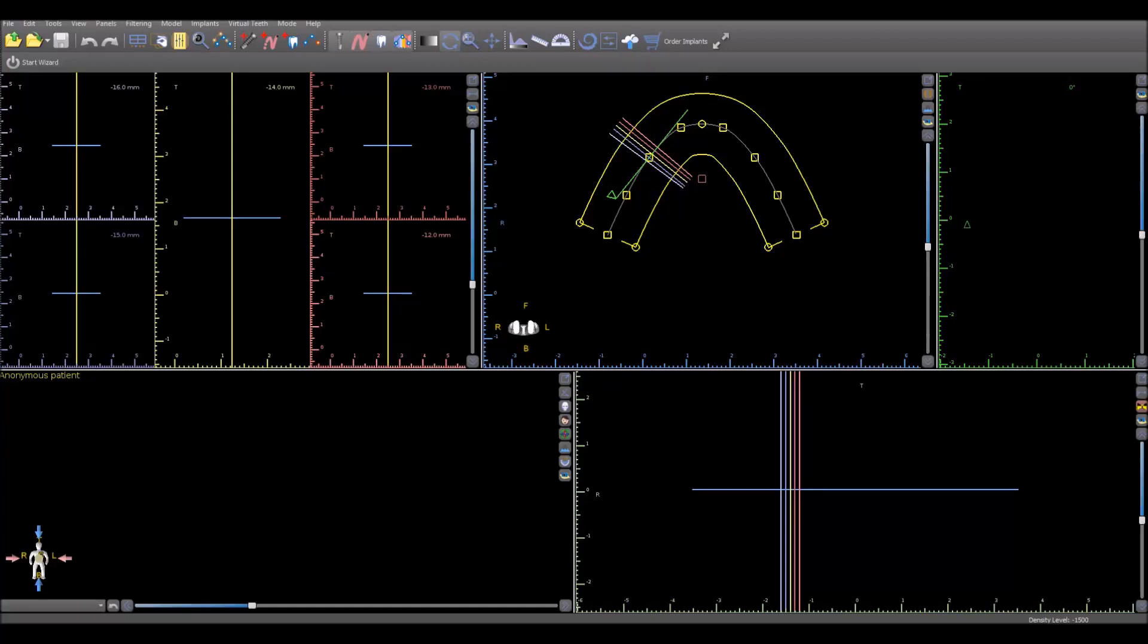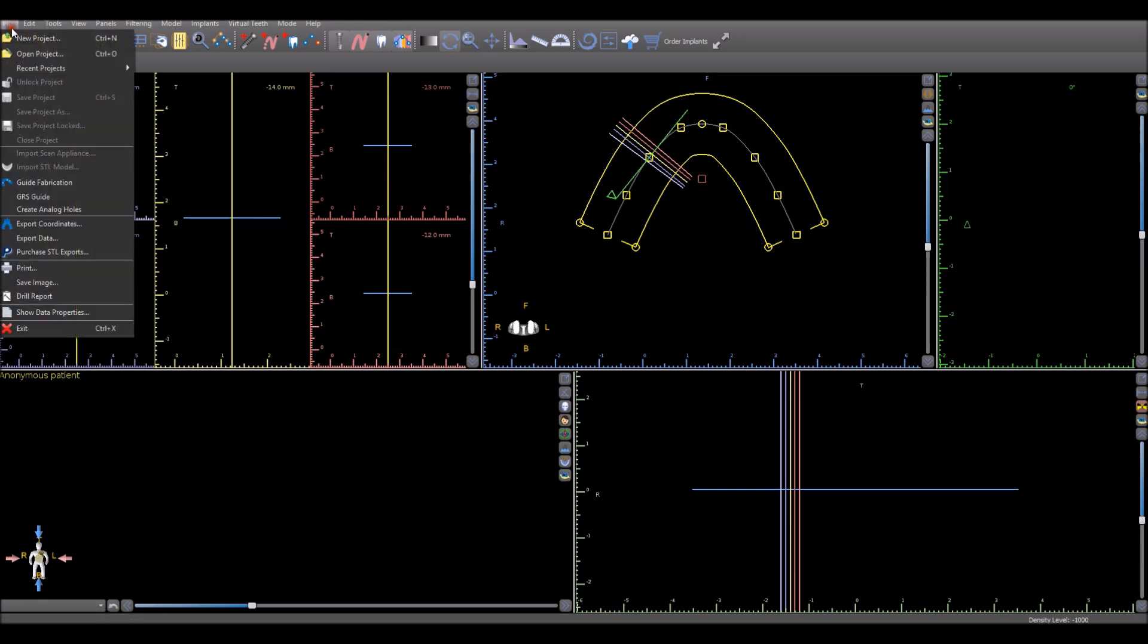This is Michael from Blue Sky Bio. I wanted to take a few minutes to run through the process of planning a case from loading the DICOMs to making the surgical guide. We received a support request today for such a video. I know we have a lot of videos on advanced functionality and webinars. We wanted to put one together showing the process flow in a few minutes.